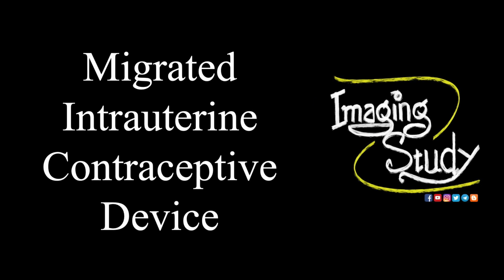Today we are going to see a case of migrated intrauterine contraceptive device. Now when we talk about the intrauterine contraceptive device, we get three things: displaced intrauterine contraceptive device, which you can see within the uterine cavity. It can be embedded into the myometrium, or it can get migrated outside the uterus. So in our case, it will be a migrated variety.